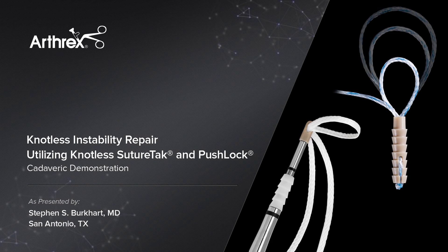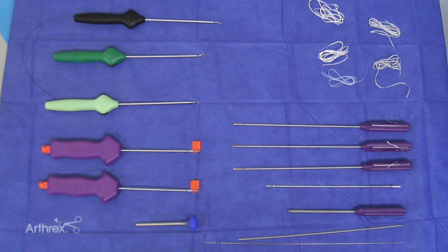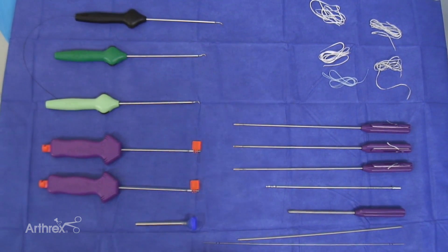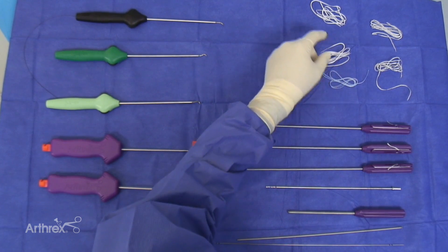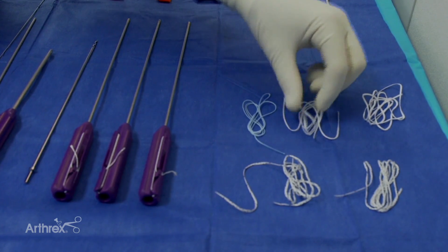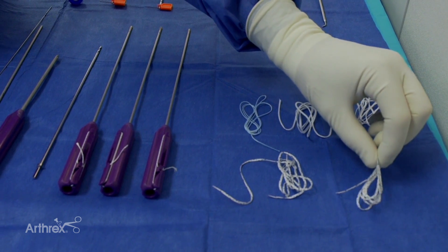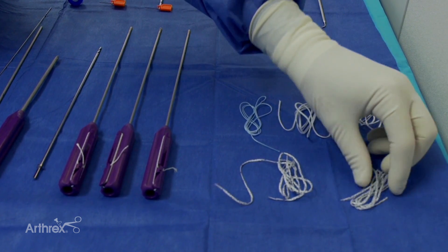We're going to show you some of the newer techniques for instability repair, focusing on newer knotless fixation techniques that are very secure. There are a couple of types of labral tape now — one that's just plain white, and we have this tiger tape that will show up better so you as a surgeon can see it more easily.